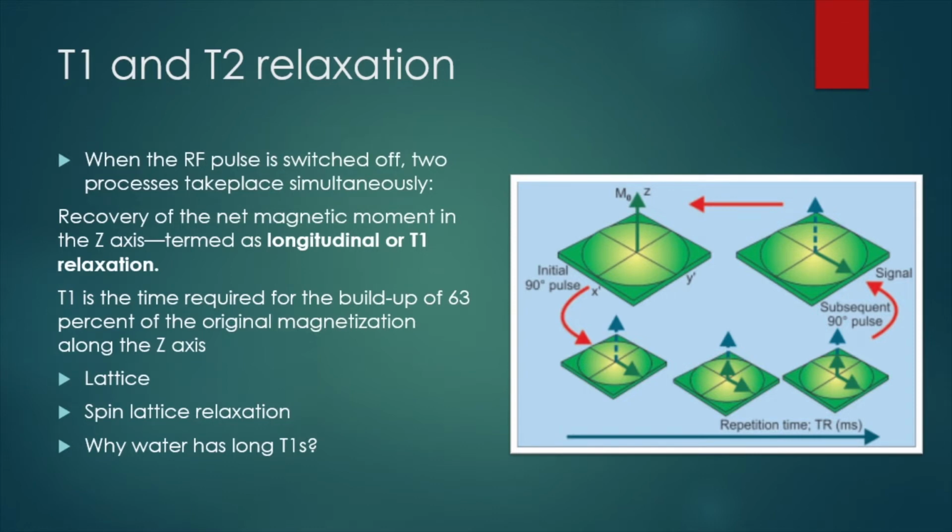So in short, if you want to explain how you get an NMR signal, what do you mean by an external magnetic field? Basically, the magnet of the machine. What you have in the bore is numerous coils which are wound round, and you pass electricity through them, so that it acts like a magnet.